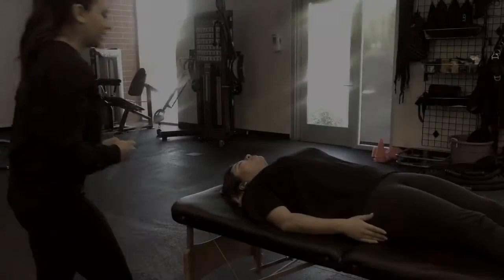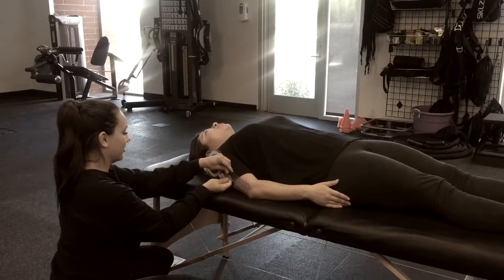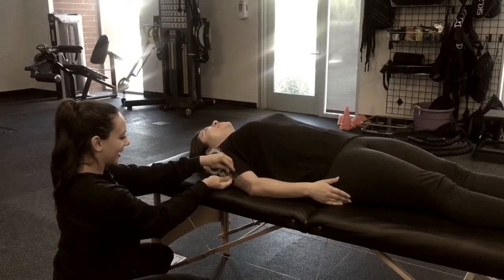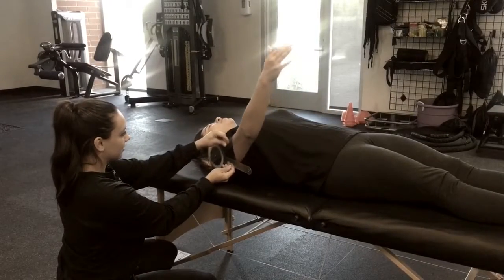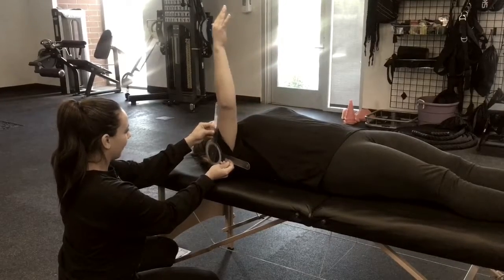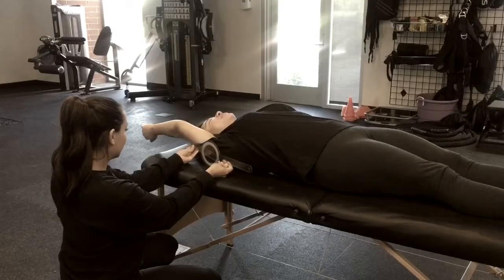Shoulder flexion range of motion. Shoulder flexion range of motion is tested with the client laying supine on the mat table, with arms extended down by their side. The axis of rotation is at the greater tubercle of the humerus. The stationary arm is placed parallel to the thorax, and the mobile arm is down the midline of the humerus.